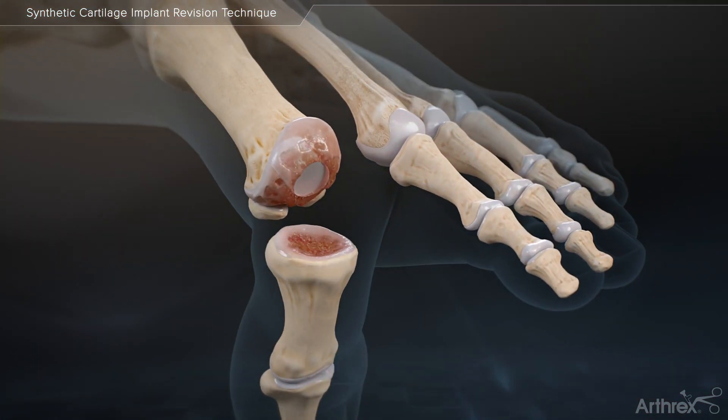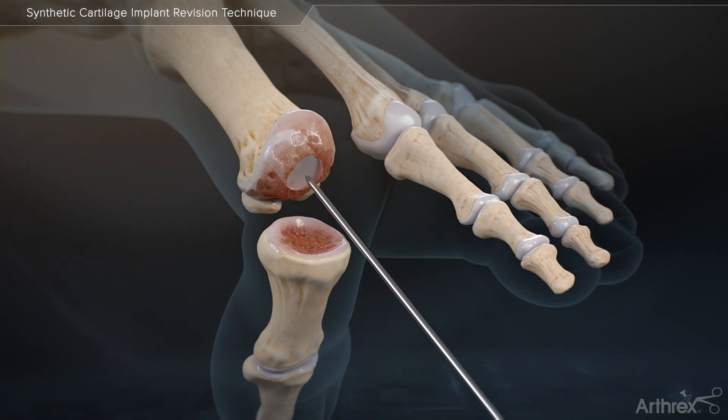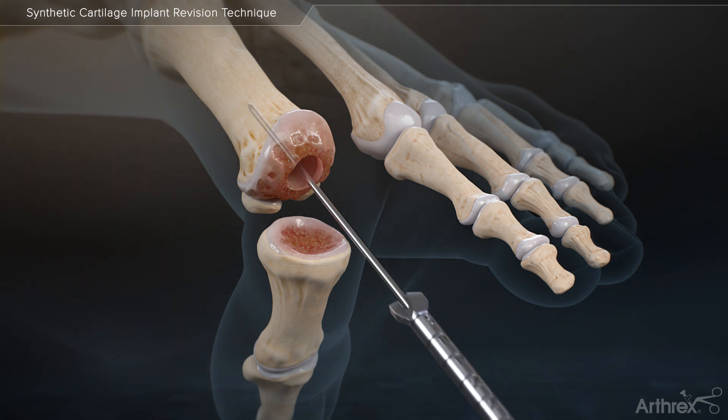Initially, a 1.6 mm guide wire is used to skewer the failed Carteva implant and remove it from the metatarsal head. The same guide wire is placed centrally into the void left from the removed implant, and the appropriately sized reamer is placed over the guide wire to prepare the metatarsal head for the bone dowel.